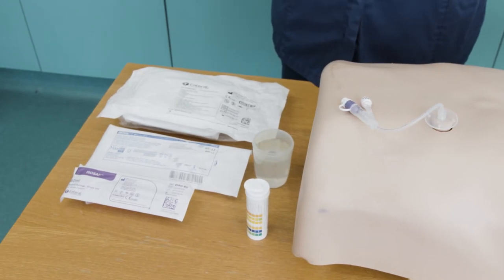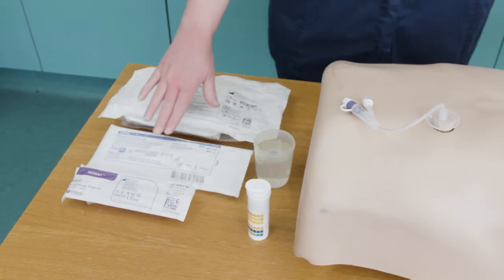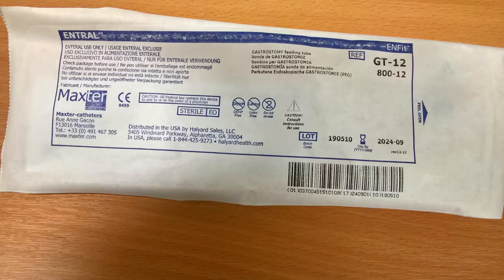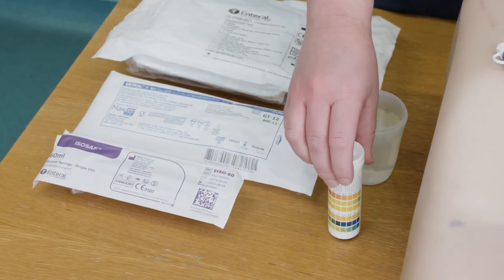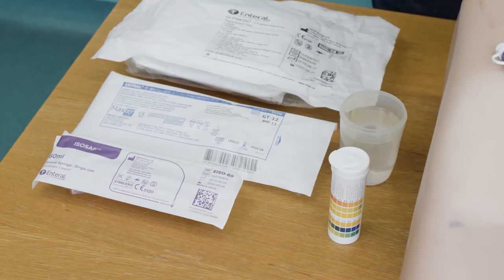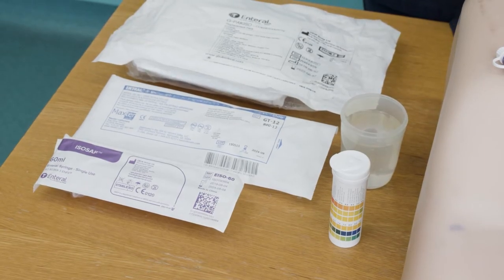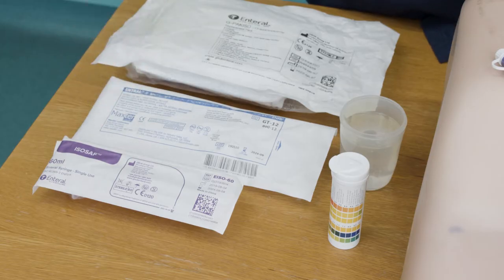The equipment you will be using: an appropriate replacement tube, CE marked pH paper, water for flushing the tube, and a 60ml enteral Enfit syringe.